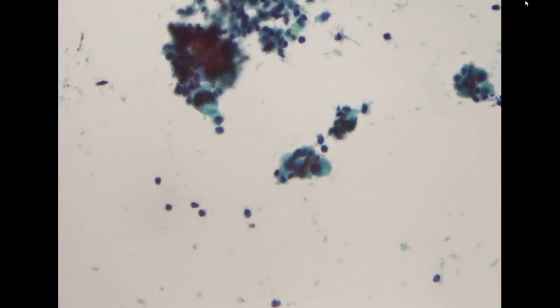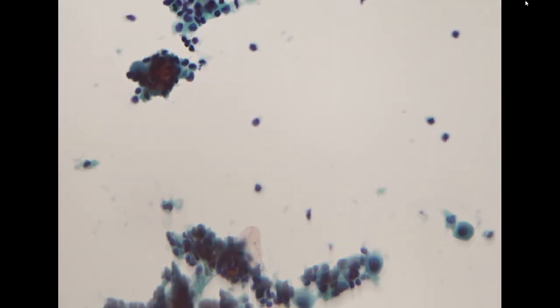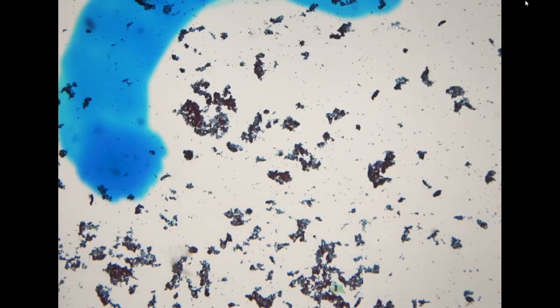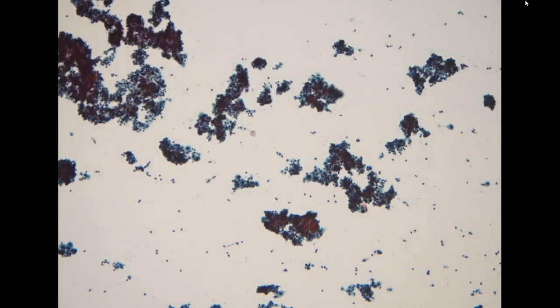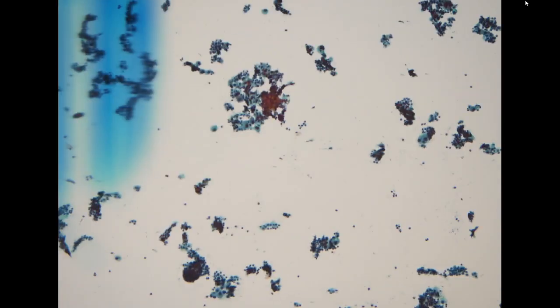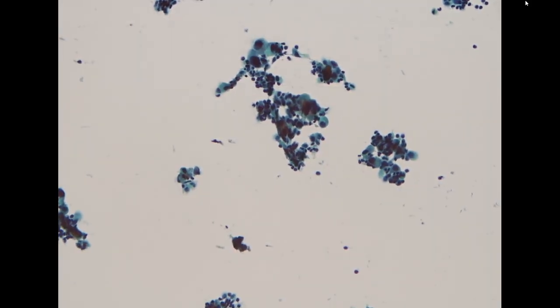So it's kind of strange because small cell carcinoma rarely transdifferentiates into a non-small cell carcinoma. So with the understanding of the clinical history, we really need to do some further evaluation on these specimens. We won't call these carcinoma right away because the clinical scenario is very unusual.